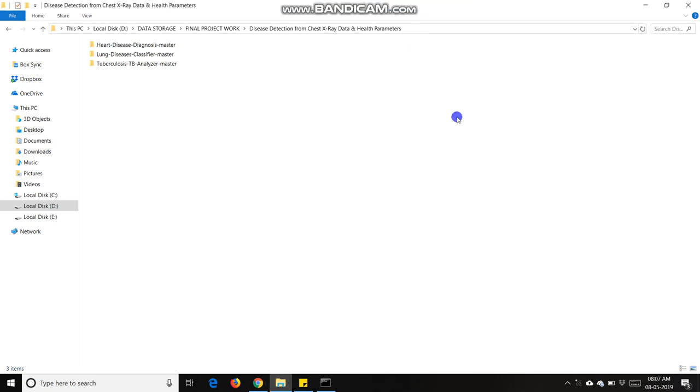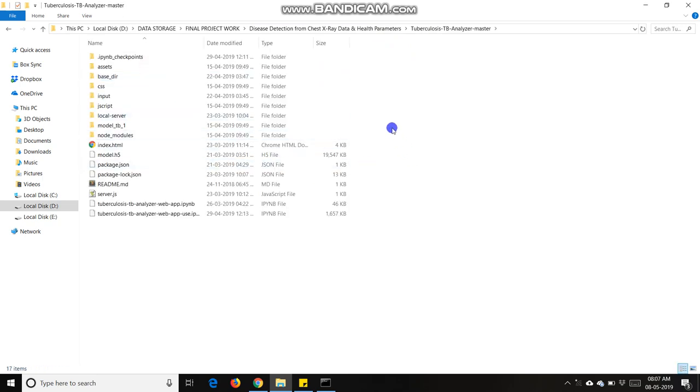My project name is disease detection from chest X-ray data and health parameters, in which I make three projects. First one I am going to discuss is tuberculosis TB analyzer master.